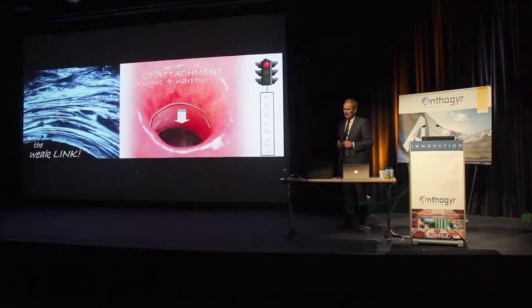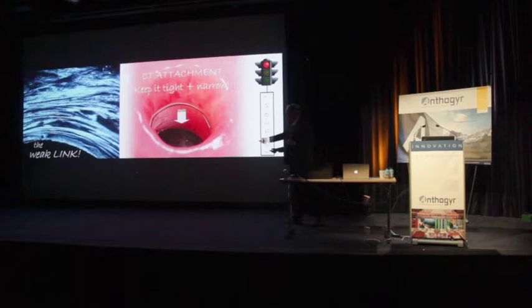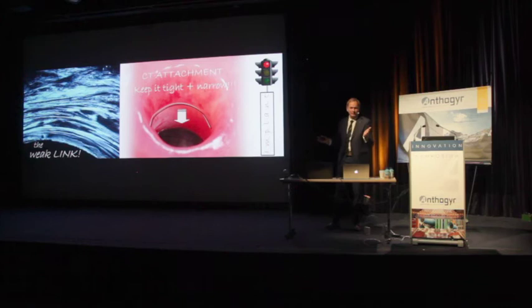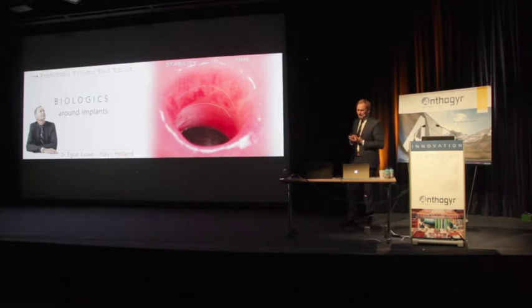So I try to keep this area in my abutment design tight and narrow as possible. Now I'm lucky with the Anthogyr connection, which on bone level implants is only 2.7 millimeter wide. So it's very small. And this is how I can emerge through this delicate area. So this is a little bit the biological background in the pink area.